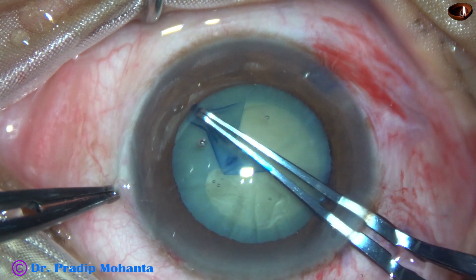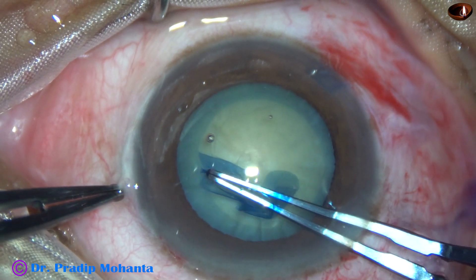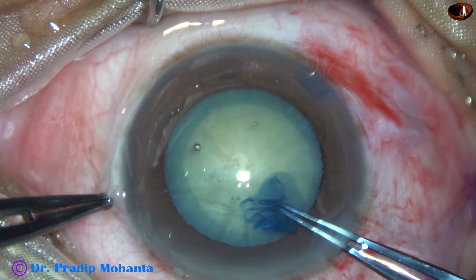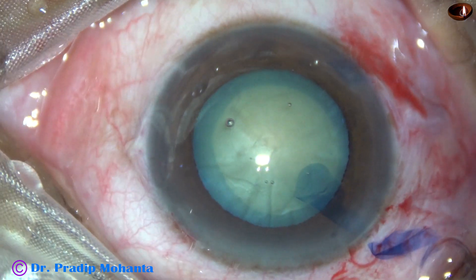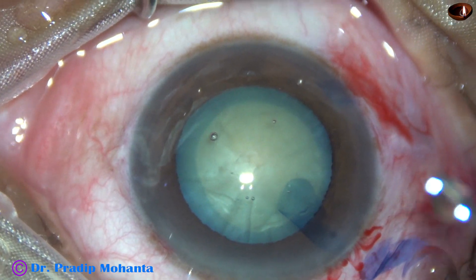Remain at a certain distance away from the margin of the dilated pupil, and I get a nice round rhexis. The size of this rhexis is about 5.5 mm.